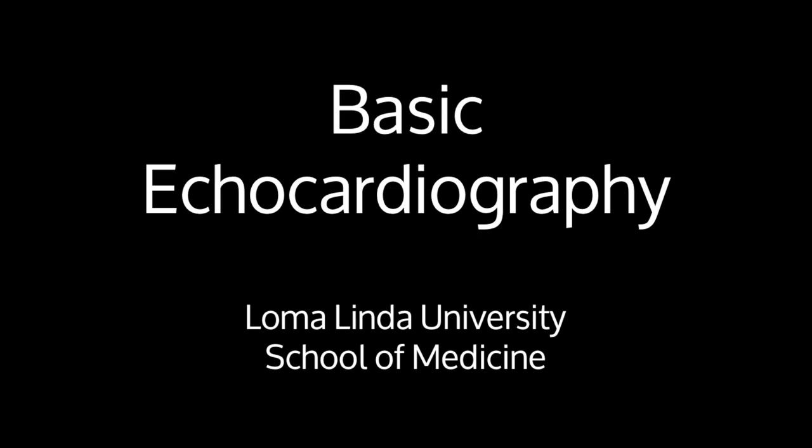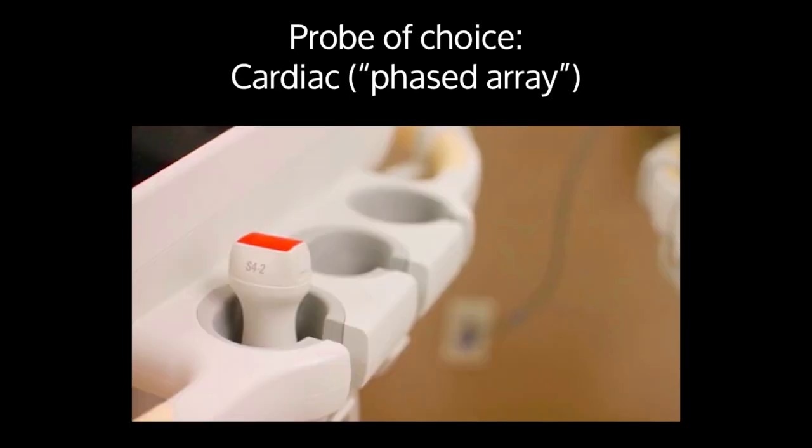Hi, my name is Mike Avila, and today we will be talking about basic transthoracic echocardiography, including the imaging windows and various pathologies. At the end, we will also talk about IVC measurements. The probe of choice for this examination is the cardiac probe, aka the phased array probe.